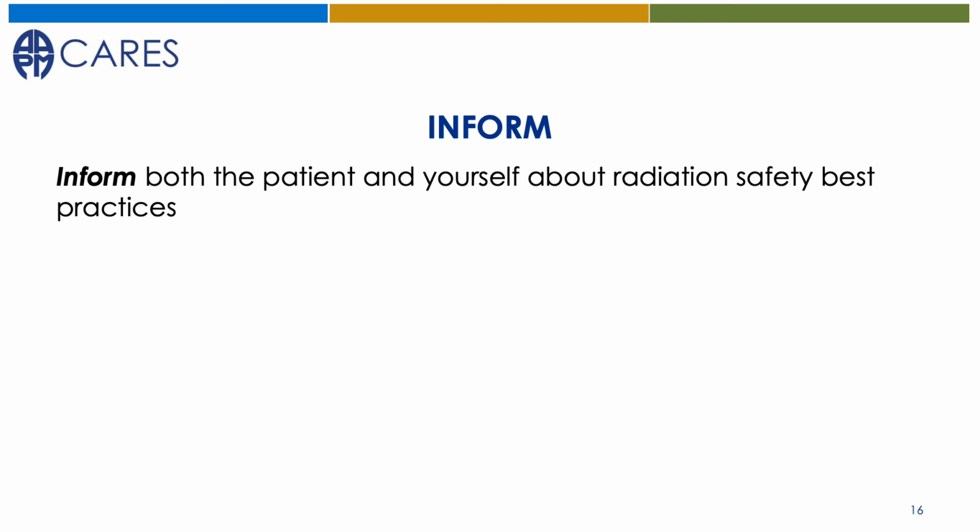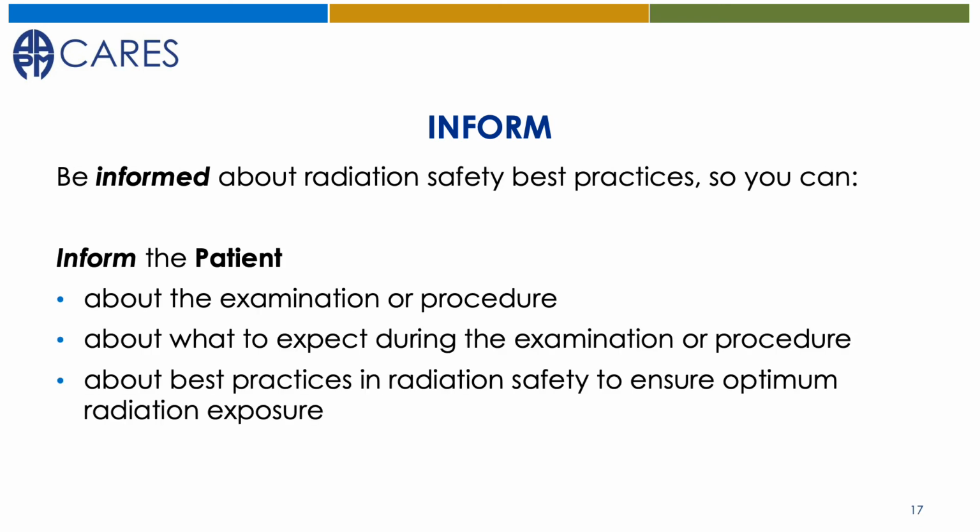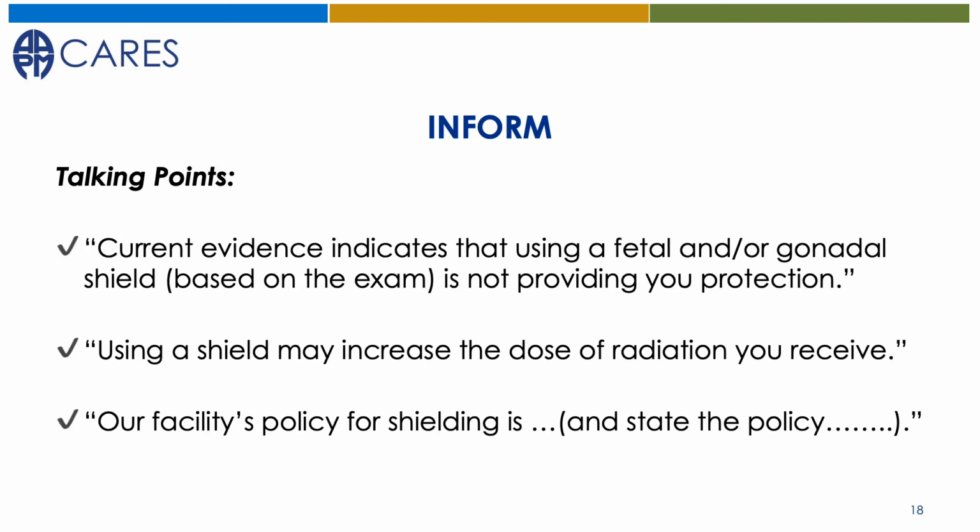I is for inform. First, you must be informed about the best practices in radiation safety. What is the best way you can perform the required imaging and keep the patient the safest? Inform the patient about the radiologic procedure and best practice in radiation safety. Utilize resources and information in these modules to help inform patients, family members, and caregivers, as well as other health professionals.